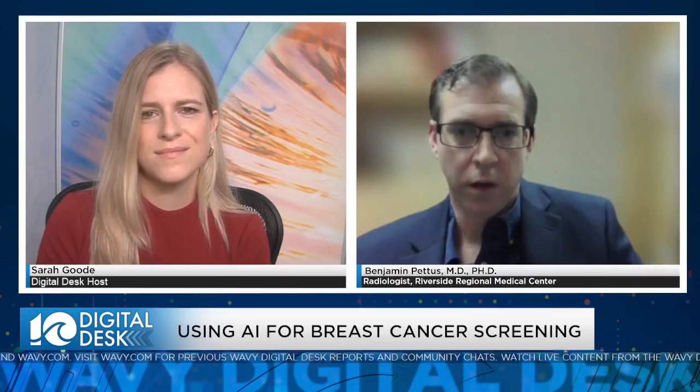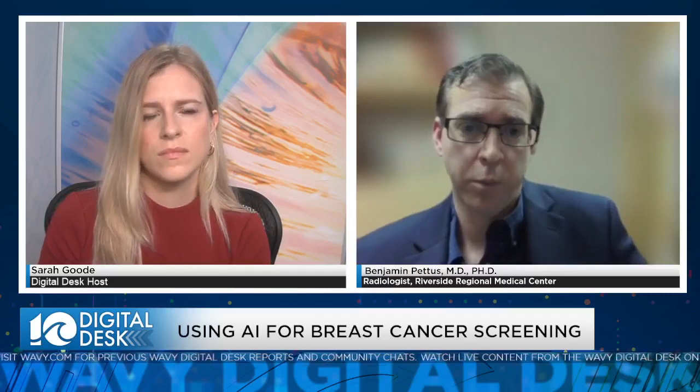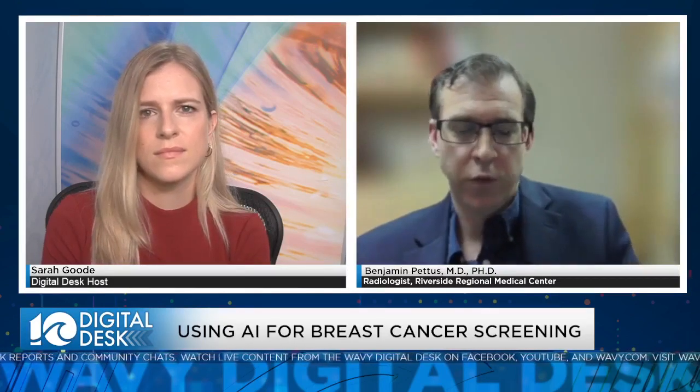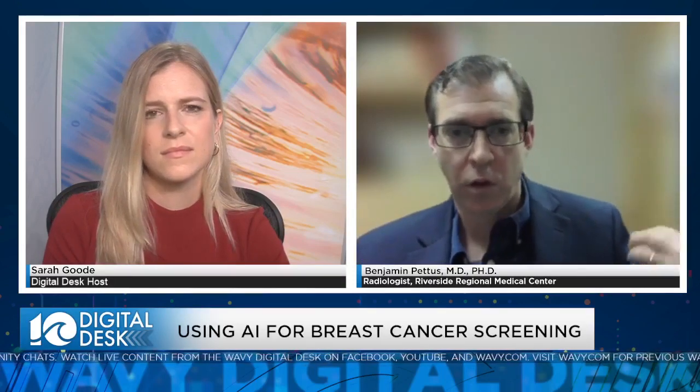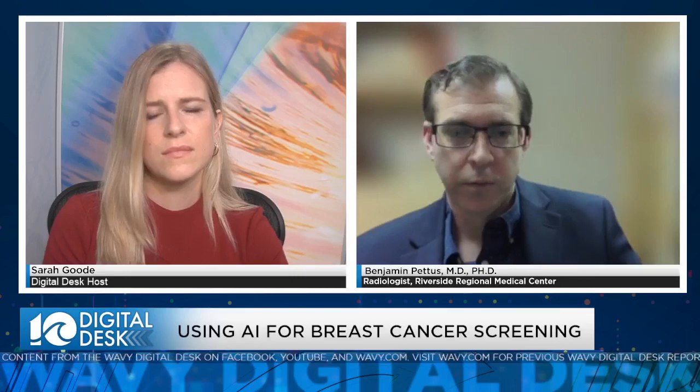So I'm going to give a talk there and do a workshop on how to use the wide angle 3D with AI, and how to bring all of this together, because our personal experience is that the average size of what we're finding is going down, and the number of cancers we can find per year is going up. We didn't previously have a lot of interval cancers that grow in that space from one yearly screen to the next. But if you can find it even smaller, it's better, because I tell patients all the time, if you wait for physical exam detection, half of the time it's already spread to lymph nodes. And the 2D mammography world was a 5-fold reduction in that, and we're trying to bring that down to ideally 0, where that is a thing of the past.